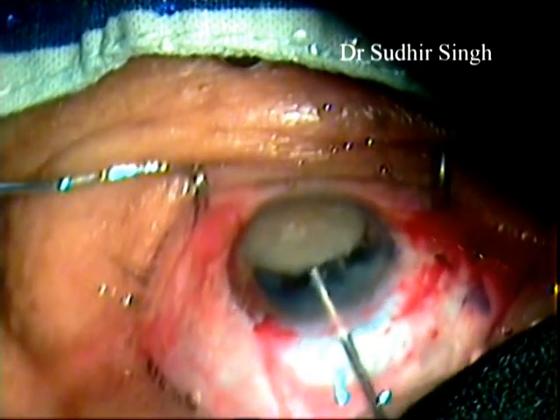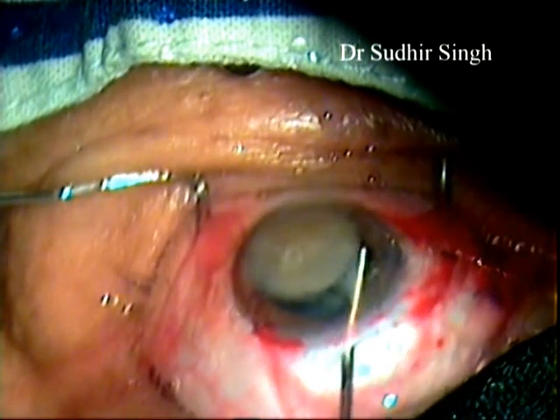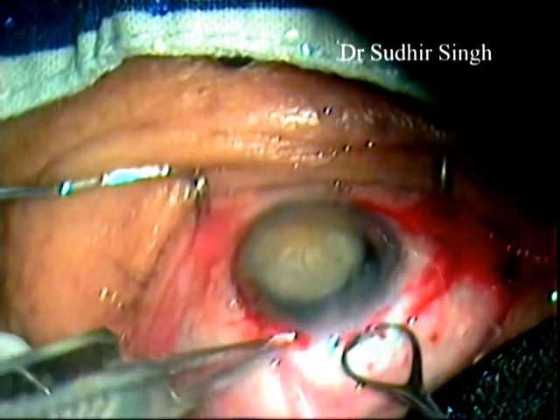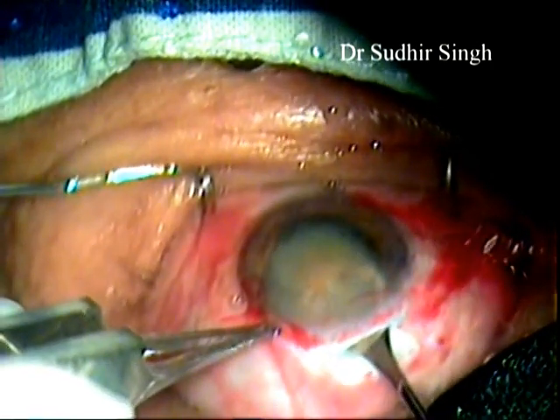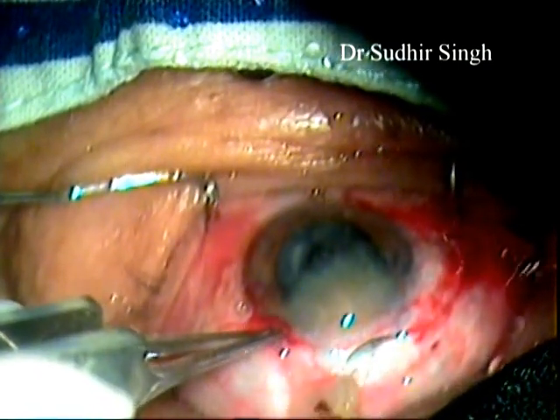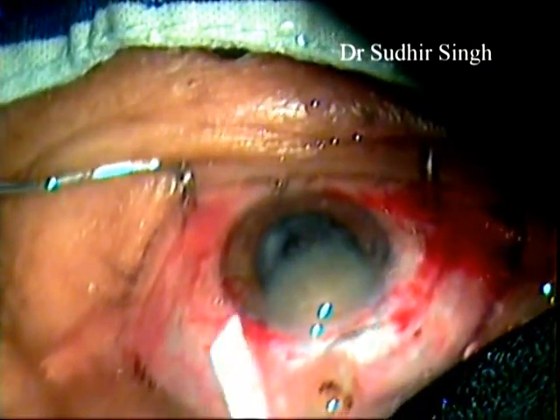A small Lewis lens loop is introduced through the tunnel and positioned between the iris and the nucleus. The nucleus is engaged in the lens loop and slowly withdrawn from the anterior chamber, while the posterior lip of the tunnel remains depressed. The nucleus is engaged in the tunnel, then the Lewis lens loop is pulled posteriorly and upwards. This causes breaking and removal of a part of the nucleus, while the other part remains engaged in the tunnel.